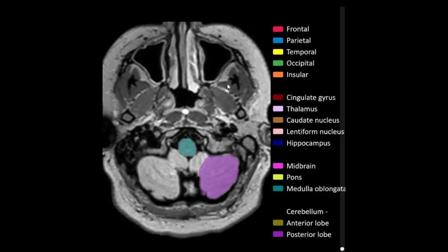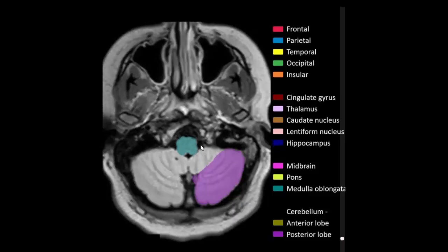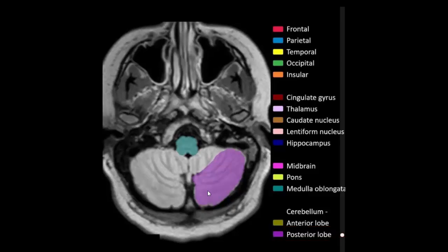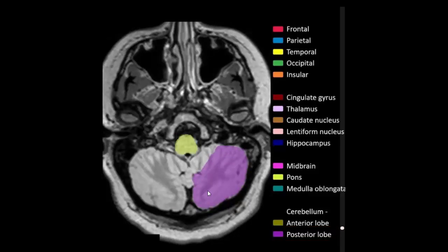Right and left temporalis muscle. Right and left lateral pterygoid muscle. Medulla oblongata. Right and left posterior lobe of cerebellum. Right and left maxillary sinus. Medulla oblongata.